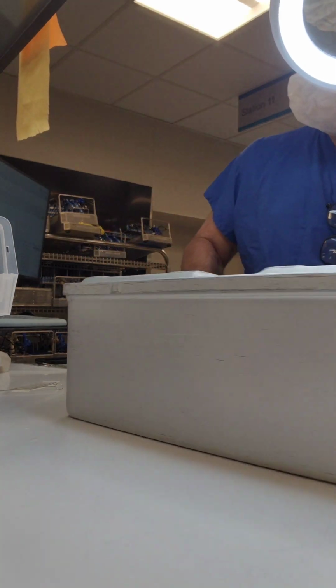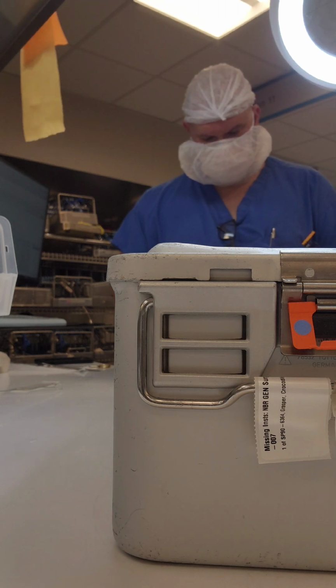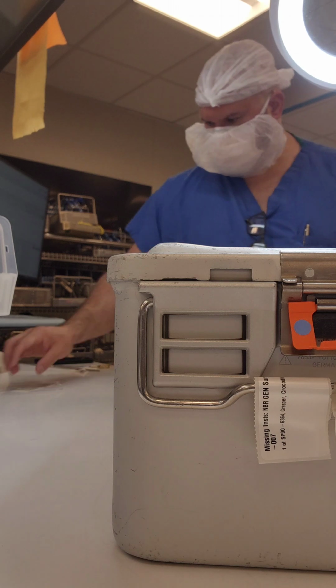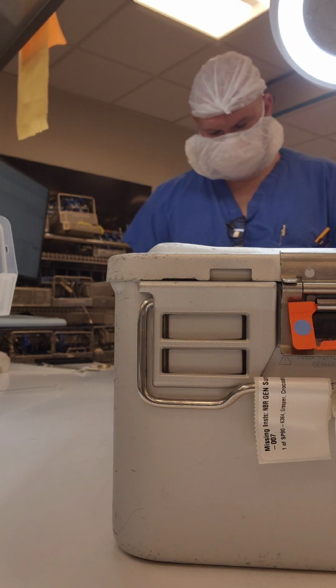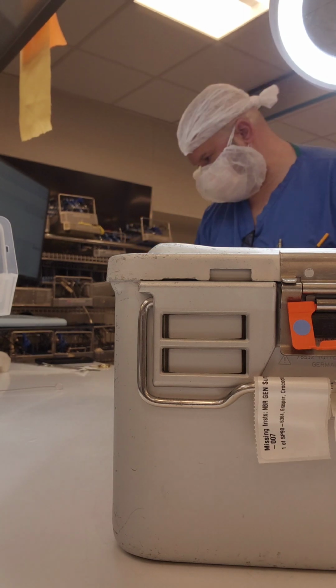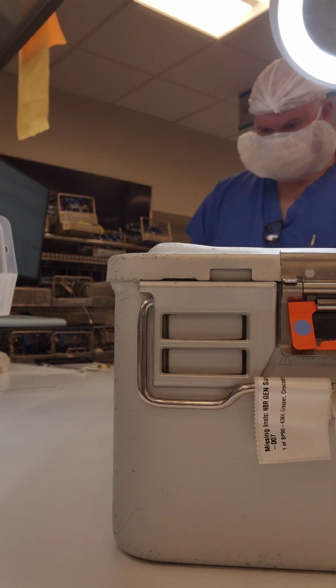I'll turn my basket around. You can see that missing instrument tag right there with the description of the instrument that's missing out of there, so you can communicate to the OR, or those that are picking a case card, that this set is missing this instrument, is it a wise choice to grab this instrument or not? Lastly, I'm placing my lot sticker control tag on there.